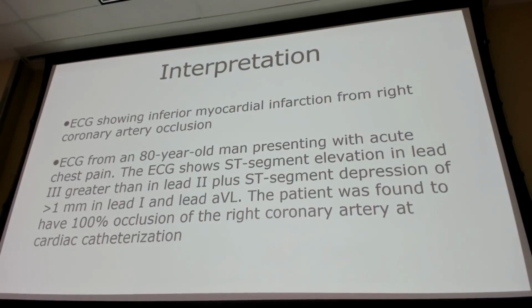All right, so here's the interpretation. This is an inferior MI from right coronary artery occlusion, and it explains what we talked about on that EKG already. He had 100% occlusion, which was found during his cardiac catheterization.